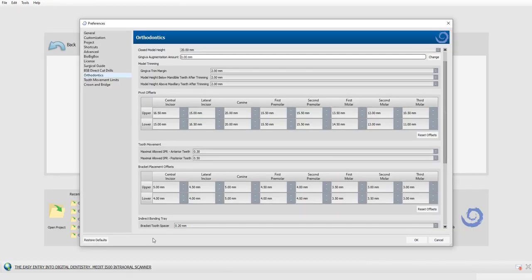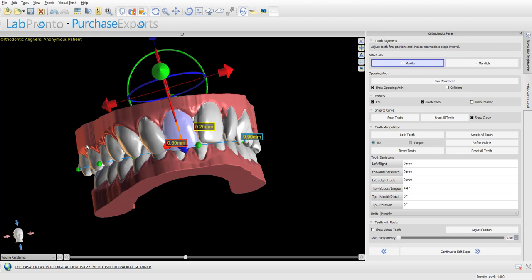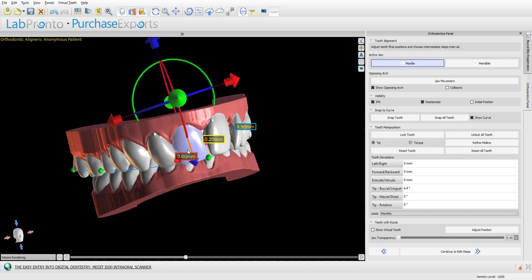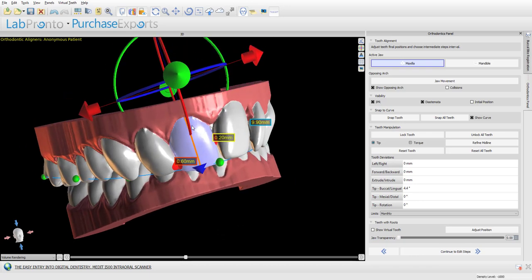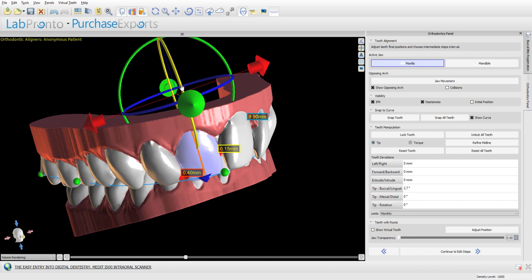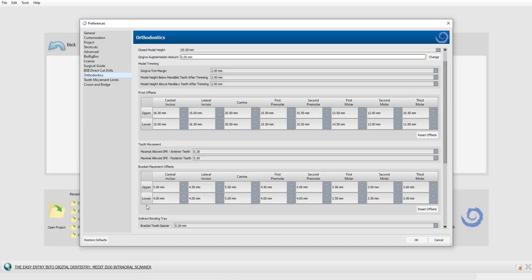The next setting is pivot offsets. At the digital tooth setup stage, the user can move and rotate teeth using the widget. The widget is positioned below the tooth, closer to the roots, so that when you use the tip functionality and grab the widget to tip the tooth, you are pivoting it based on a point below the tooth. If you want the widget placed initially higher or lower, you can change these offsets.